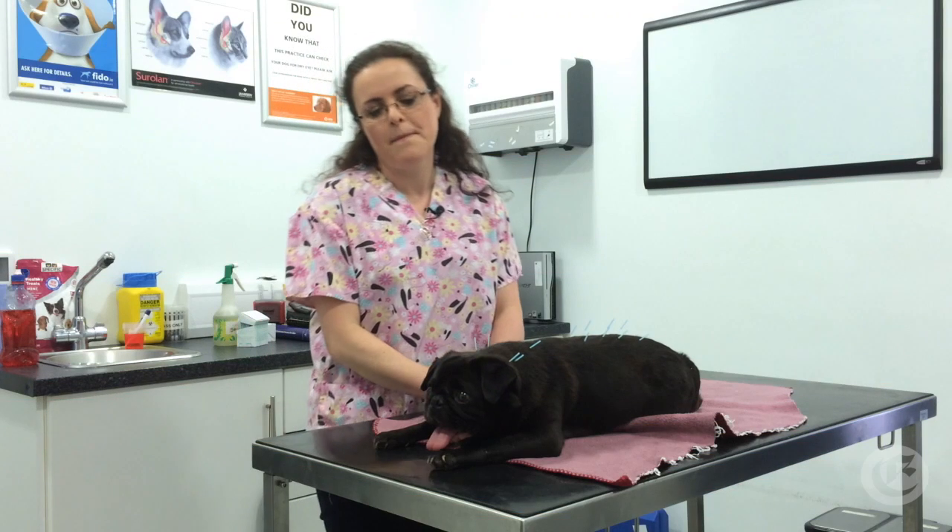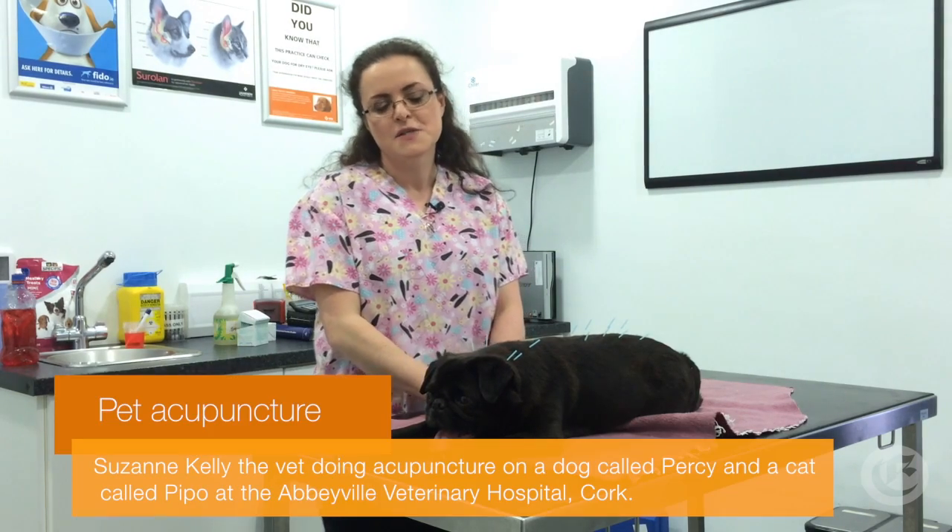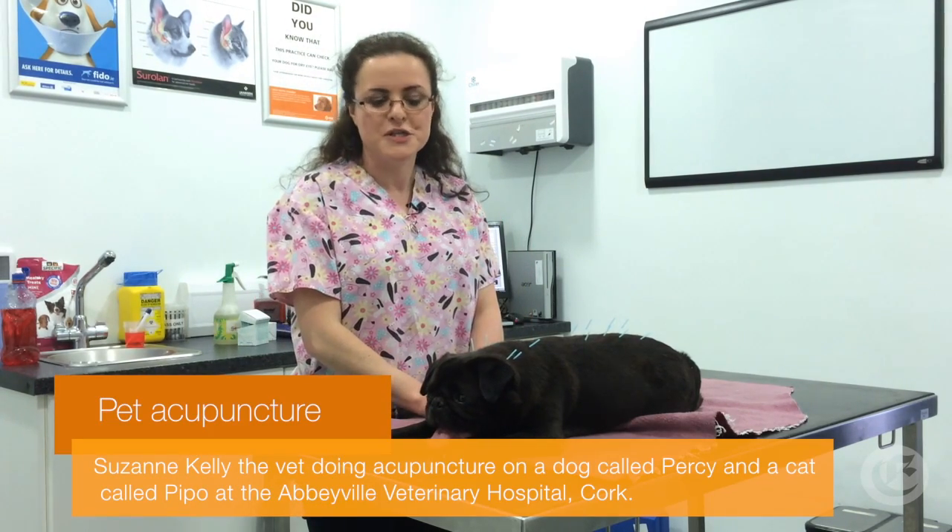This is little Percy. He's got back and neck problems and hasn't been able to walk very well for the last few days. So we're trying to help him by doing some acupuncture.